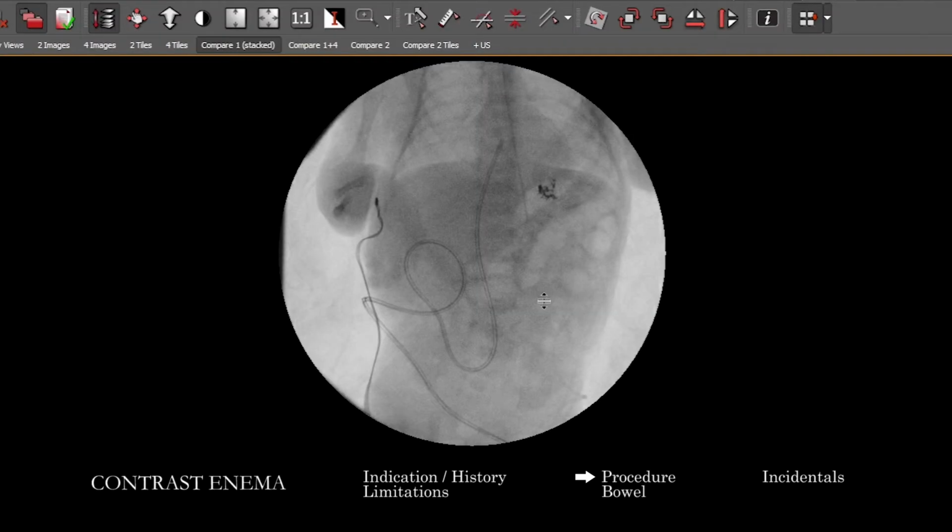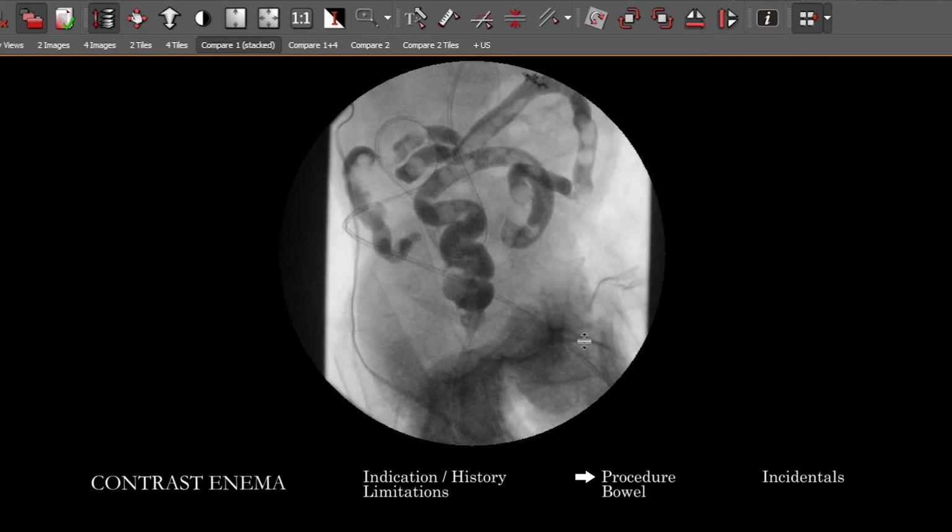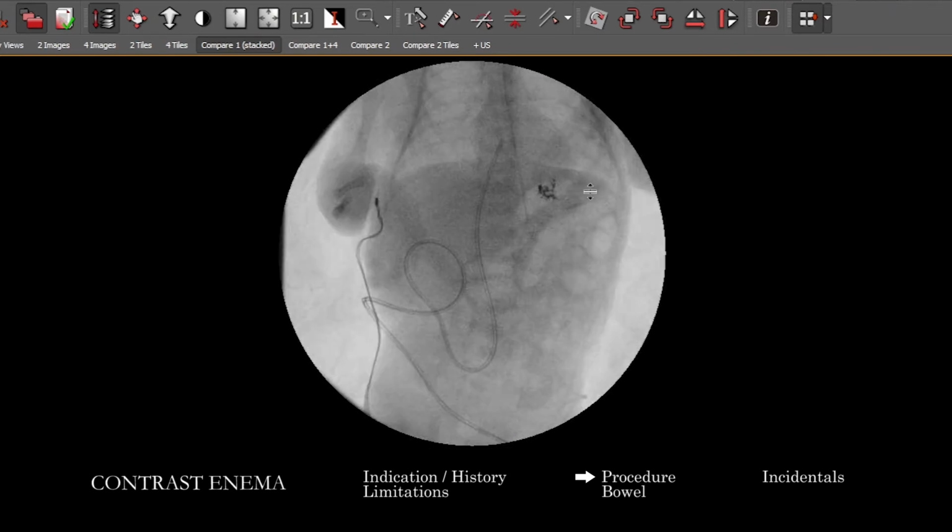Okay, so here we have what a typical study can look like. I'll just go through the images very quickly, and then we'll start again from the beginning. Here we're going to talk a little bit about the procedure of how to do it, but we'll just touch on the major points, as it's best to actually be in a room and learn how to manage the logistics of actually performing the study. So I'll touch on the major points here before we go through the actual imaging.